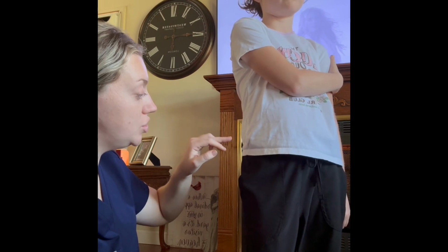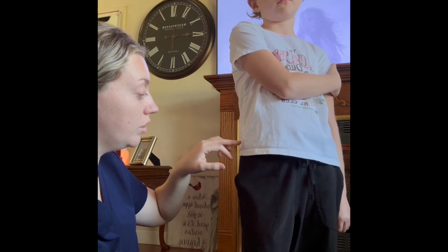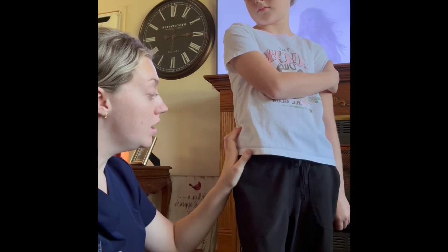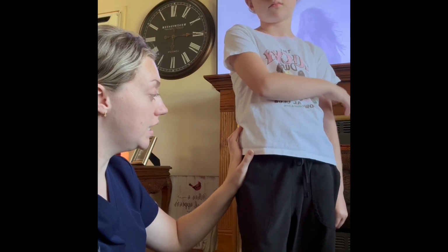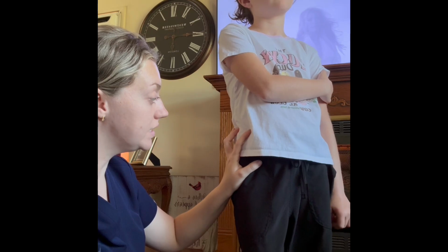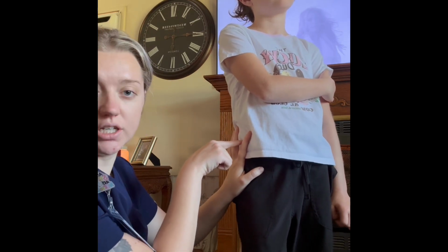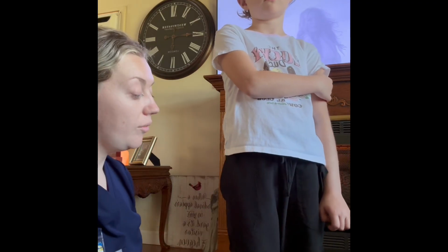I would want to inject it here into the ventral gluteal muscle. So I would start by locating the patient's iliac crest, place my palm on their greater trochanter, and then I'm going to rotate my index finger towards the anterior iliac spine, and then I would give the injection in between my pointer and middle finger there. So that is how I would find the injection sites for an intramuscular, a subcutaneous, and an intradermal injection.